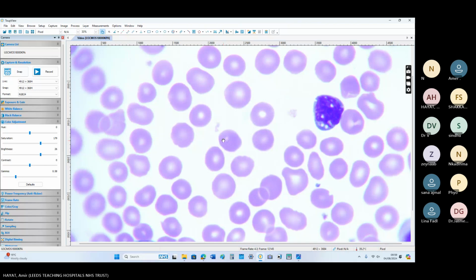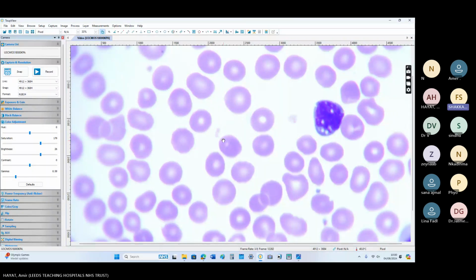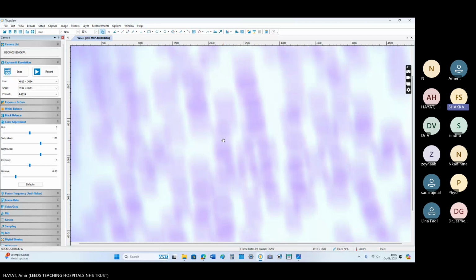Oh. So this patient has no background history, and she presented to you first time with a large abdominal mass and lymphadenopathy everywhere, cervical area, axillary, inguinal area, with B symptoms. And you have seen these large cells with basophilic cytoplasm and vacuolation. I think Burkitt should also be on the top of the differentials because of these vacuoles in the cytoplasm plus blasts.